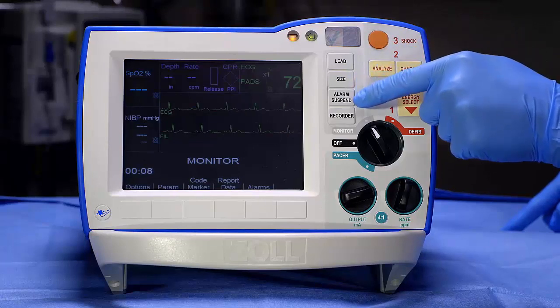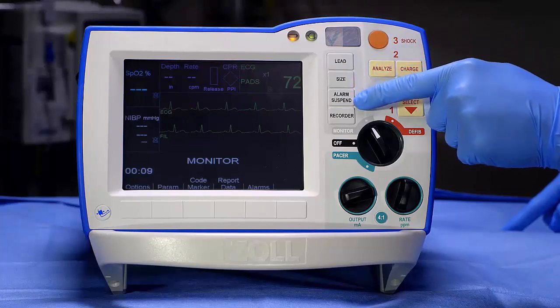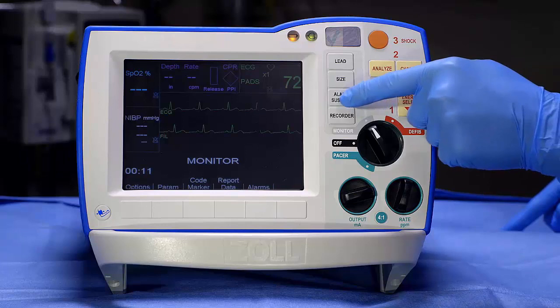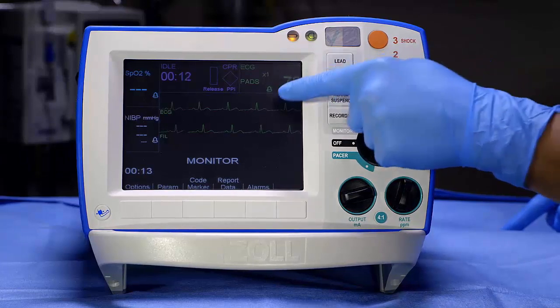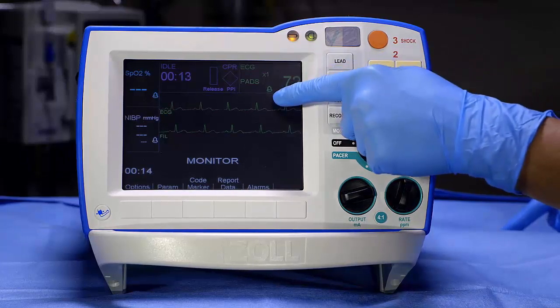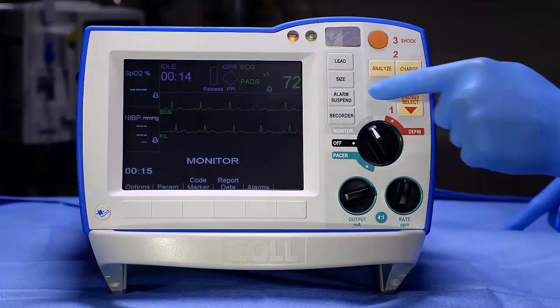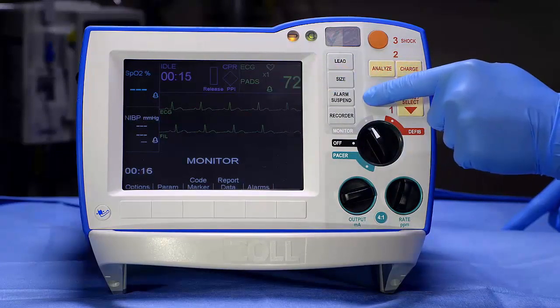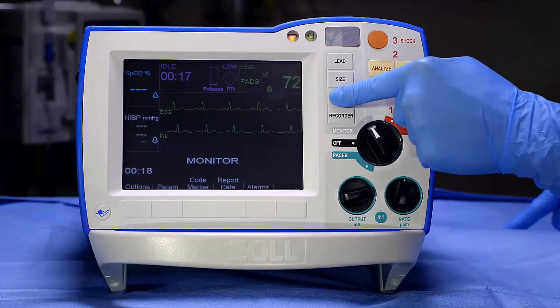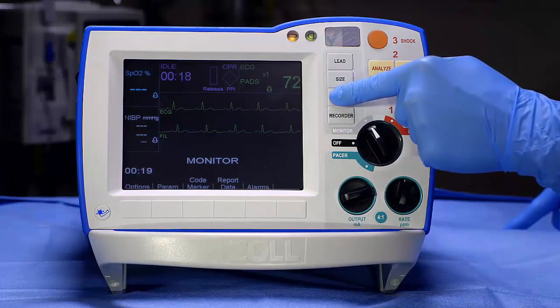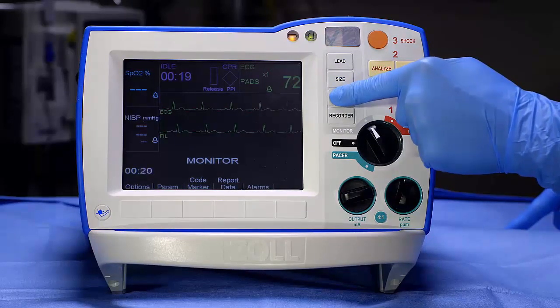Alarms are automatically disabled when the device is first turned on. Press Alarm Suspend to enable alarms. To silence an alarm for 90 seconds, press and hold the Alarm Suspend button for 1 second.